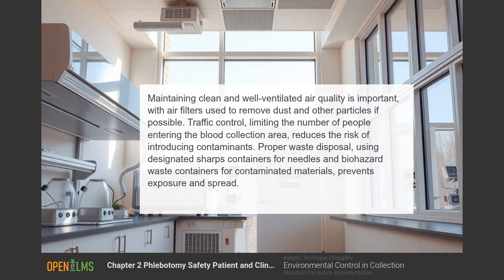Maintaining clean and well-ventilated air quality is important, with air filters used to remove dust and other particles if possible. Traffic control. Limiting the number of people entering the blood collection area reduces the risk of introducing contaminants. Proper waste disposal. Using designated sharps containers.